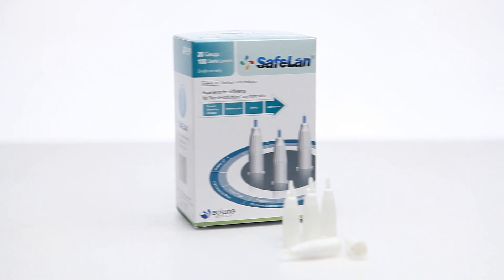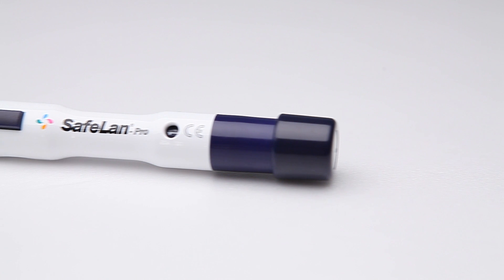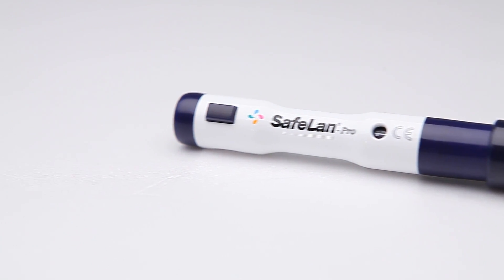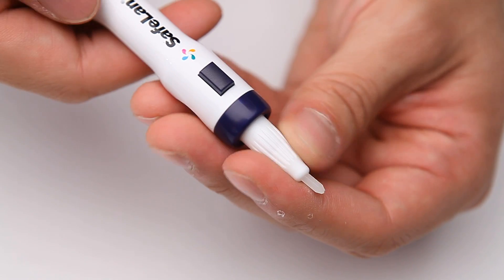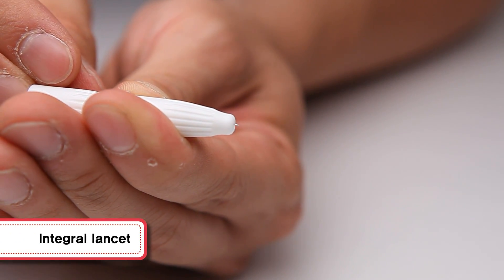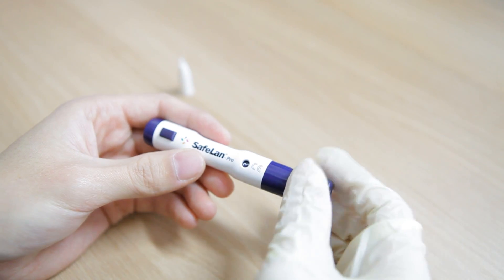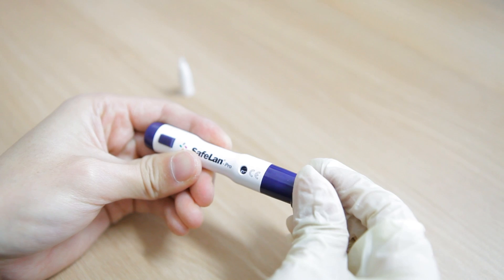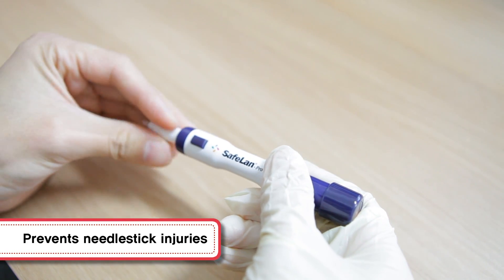Bosung Meditech's SafeLan Pro, which uses SafeLan 30G, differs from existing common blood collecting devices by improving its hygienic aspect. It uses a lancet that is designed to integrate the needle stick and protect the cap of the blood collecting device. So the needle never sticks out, except when being used, preventing needle stick injuries caused by careless use.